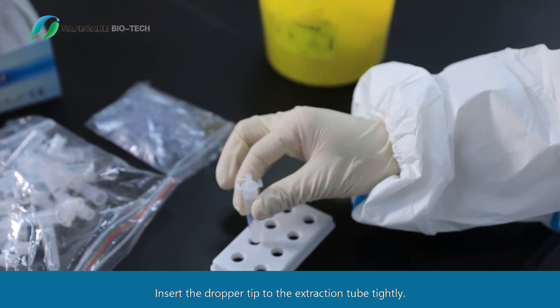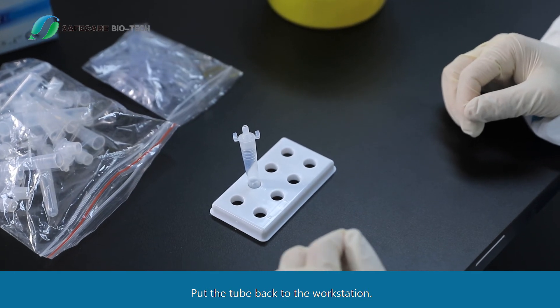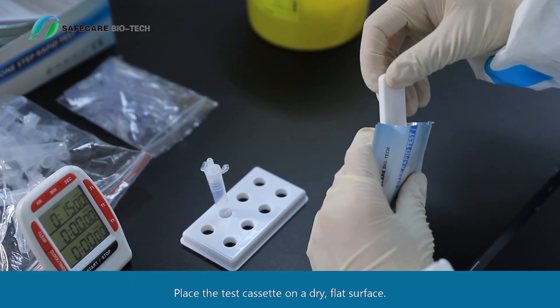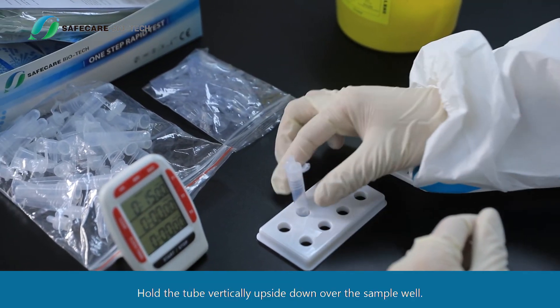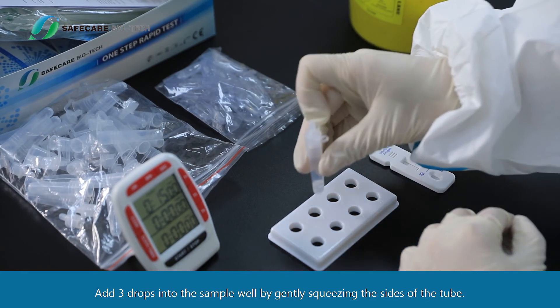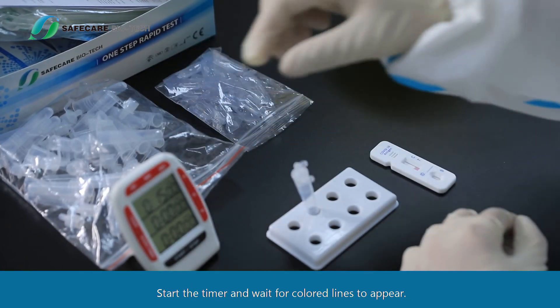Insert the dropper tip into the extraction tube tightly and put the tube back on the workstation. Open the sealed pouch and take out the test cassette. Place the test cassette on a dry, flat surface. Hold the tube vertically upside down over the sample well and add three drops into the sample well by gently squeezing the sides of the tube.